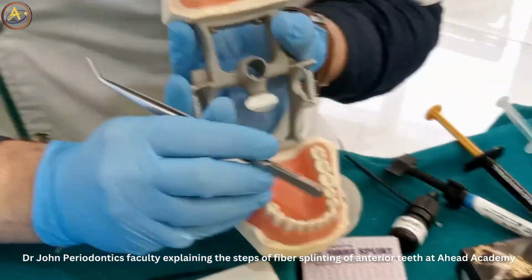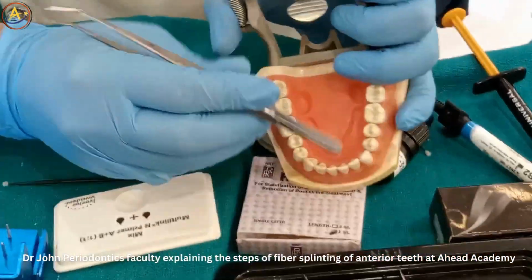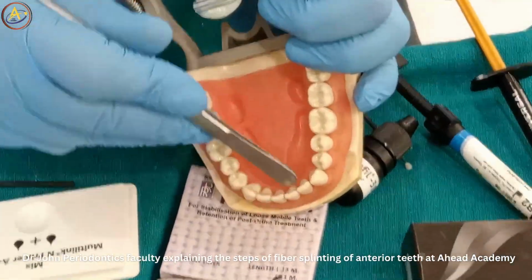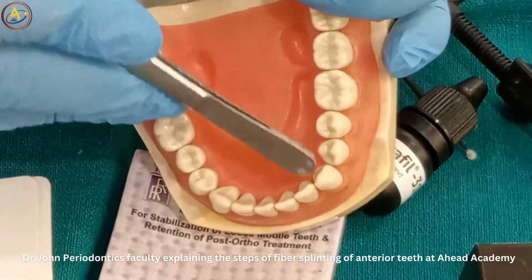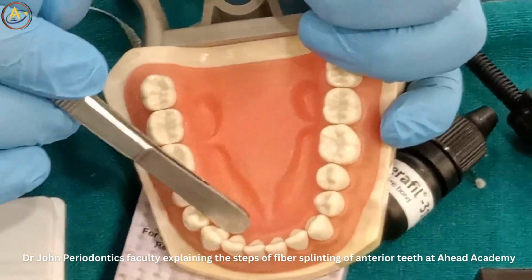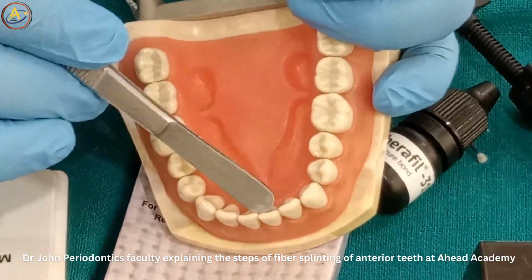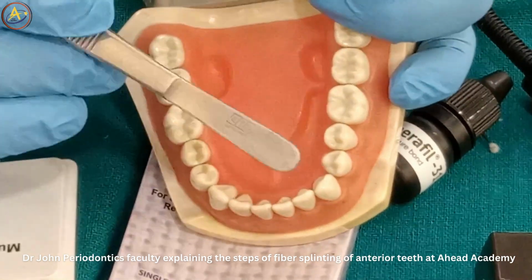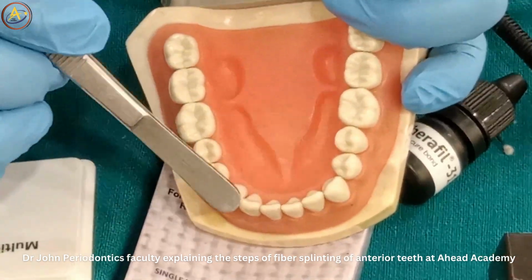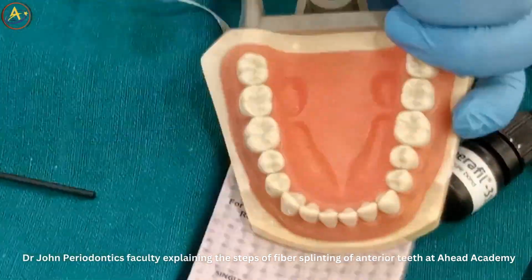Then the second rule is that if you want to do splinting in the anterior teeth, the best splinting is from canine to canine. Okay, why? Because the canine is the strongest tooth, it gives support, and mostly in case of a patient, the lateral to lateral teeth are very much mobile. So support is always from the canine to the canine. Okay, so what do you start with first?